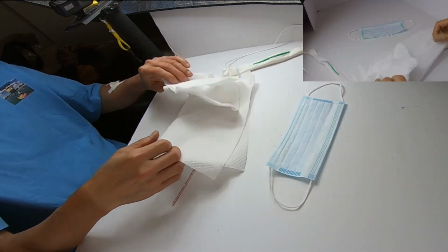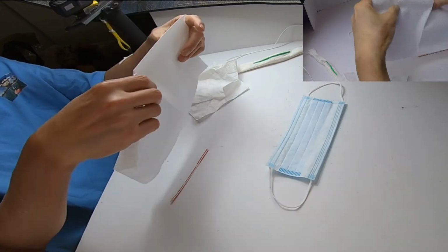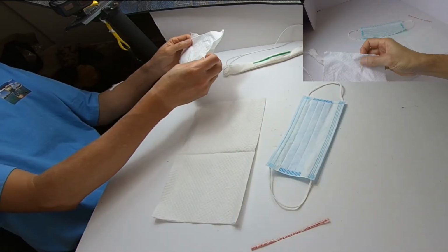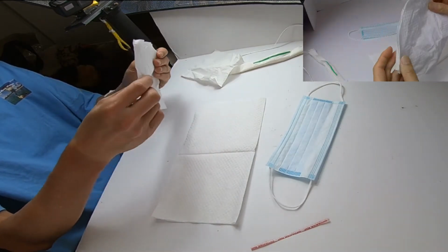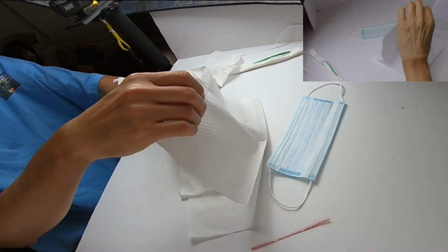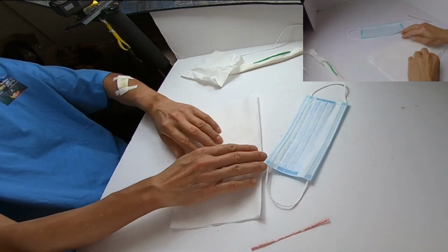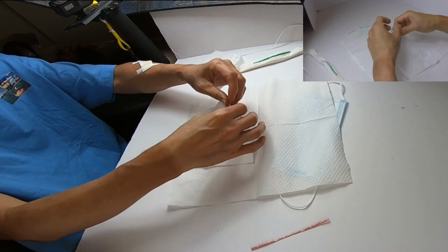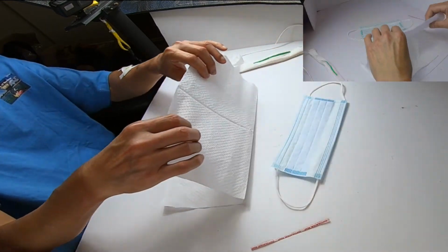So in comparison, we'll take a look at a standard napkin, which is thin as well and almost translucent. But if you open up the napkin, it has inherently 2 layers. You get a napkin and you cut it in half, and now you have 2 layers as well. So to start off, we're going to put a layer in between the napkin and seal it. And at this point, you have a face mask filter that is 4 layers thick. Sometimes you do have to adjust it a little bit. It's probably better to put it edgewise this way, because then you have a little bit of space on the bottom. And fold it down.